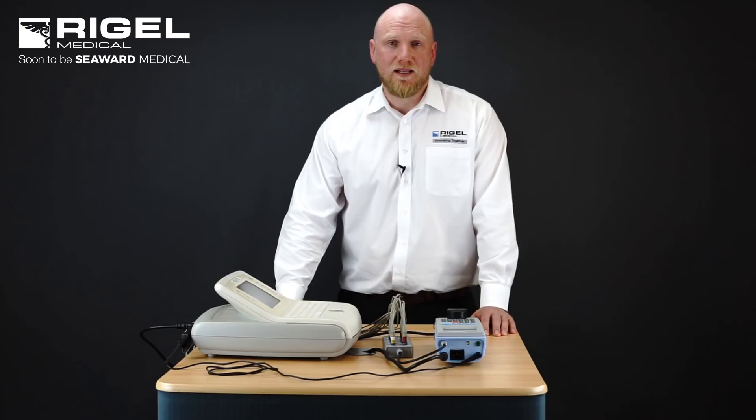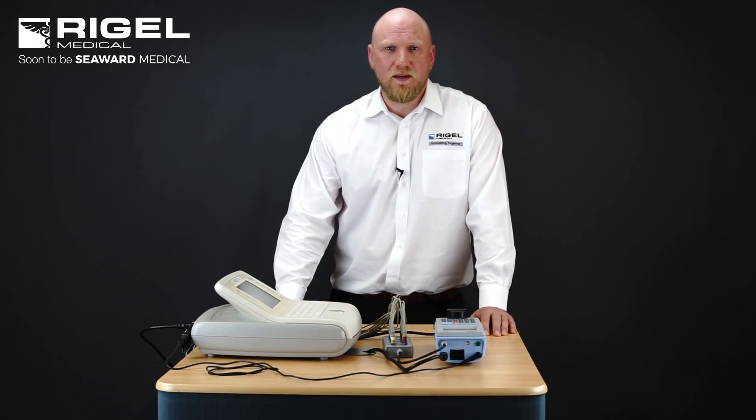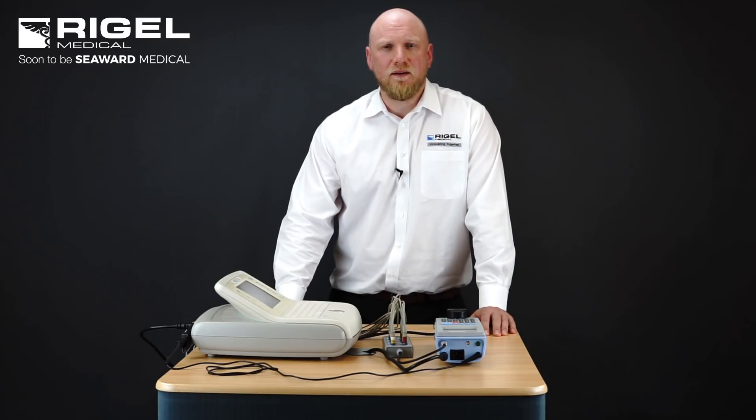Specific to IEC 62353 we have three leakage methods: the direct method, the differential method and the alternative method.